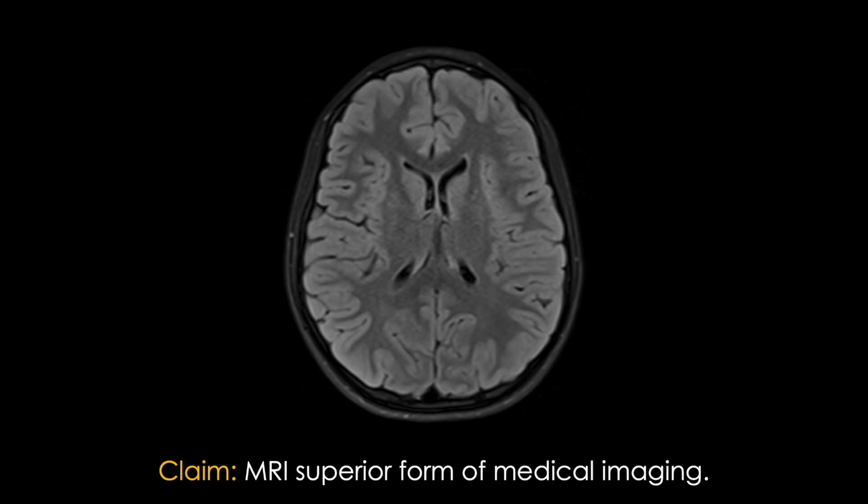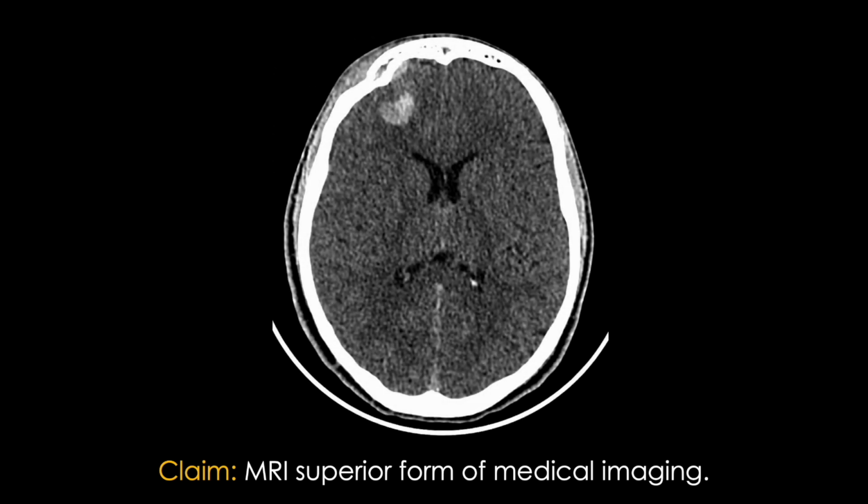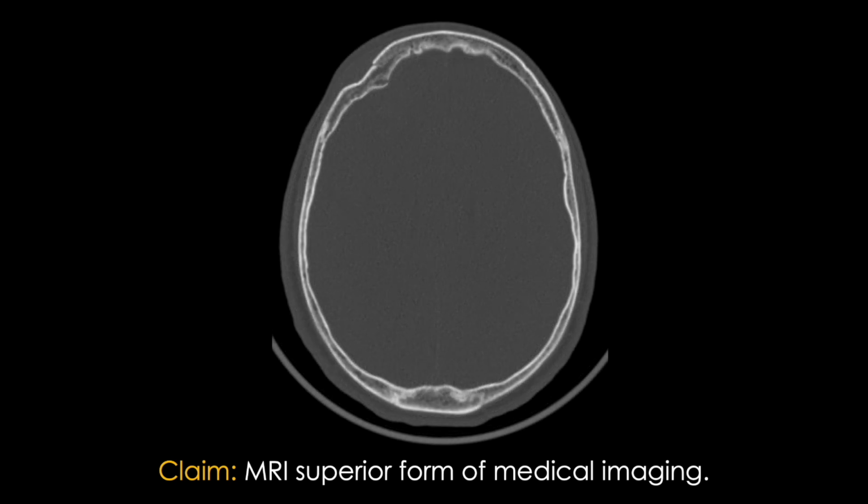to the most important question in medical imaging. What is it you're trying to see? Sure, this MRI of the brain looks pretty, but let's say a patient got into a car accident and you are worried about a head bleed. Do you need a fancy MRI scan to diagnose that? Nope. A quick and cheaper CT scan is great for seeing acute bleeds, like this one in the right frontal lobe.